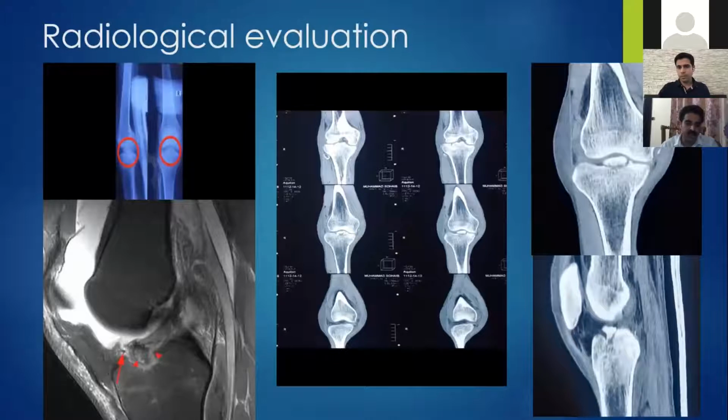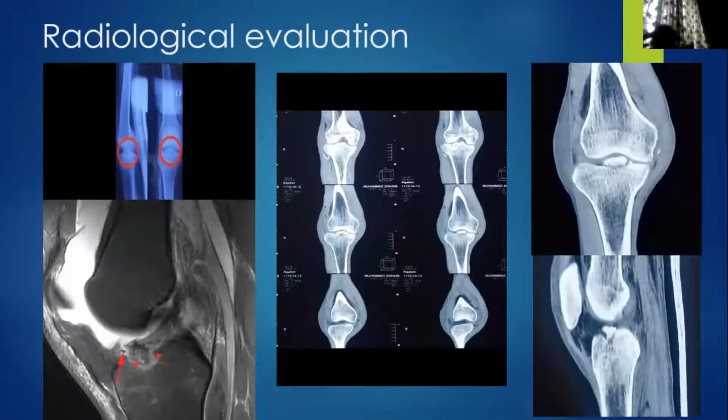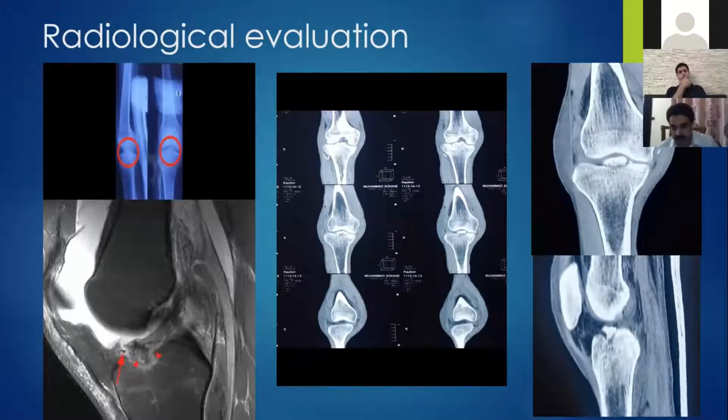On the plain radiograph in the left upper corner, there is a tibial eminence fracture, that is the displaced one. We did the CT scan and MRI as well, to rule out the geometry, the comminution and the displacement of the intercondylar eminence fracture. You can see in the coronal and the sagittal view, it is a displaced fracture.